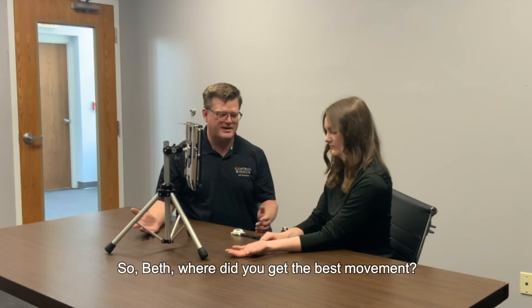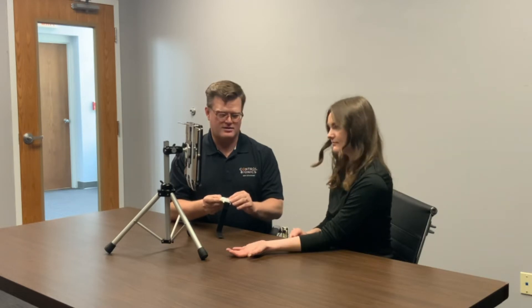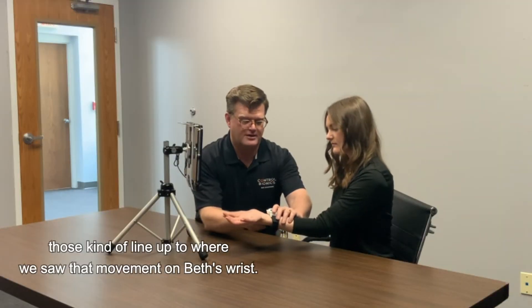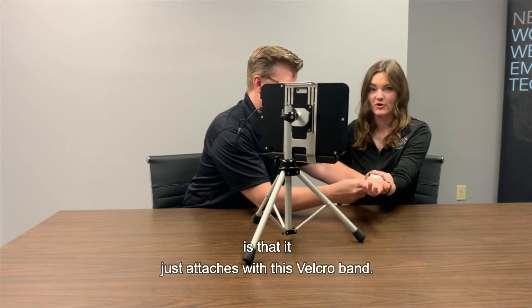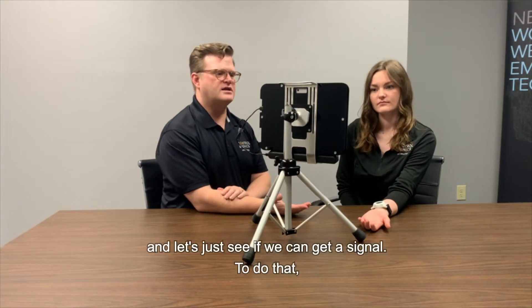So Beth, where did you have the best movement? It looks like right here. I'm going to grab the NeuroNode and make sure that it is facing Beth. There are two indentations — we're going to line those up to where we saw that movement on Beth's wrist. The great part about the NeuroNode is that it just attaches with this Velcro band, so if you need to make adjustments, it's super easy. How's that feel, Beth? Feels great. All right, let's put our hand at rest and see if we can get a signal.